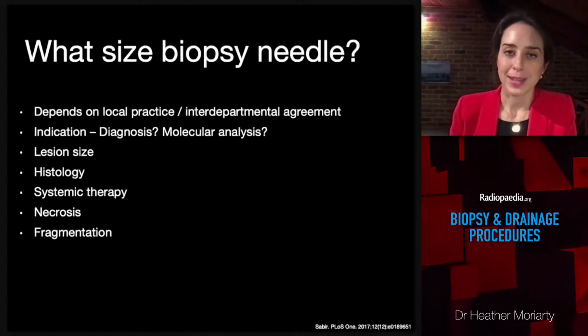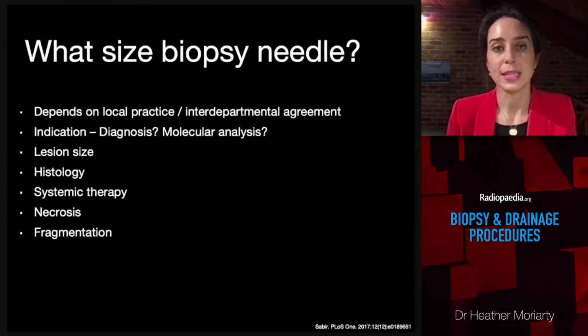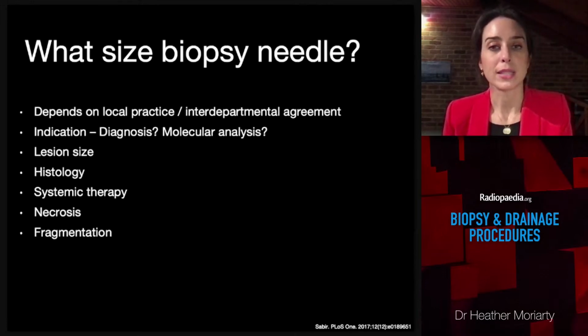What size biopsy needle? Well, there is no simple answer to this one. It depends on a number of factors, like how much tissue is needed, the lesion location, size, tissue type, and so on. More and bigger samples tend to increase diagnostic accuracy up to a point, but will also increase the risk of complications.